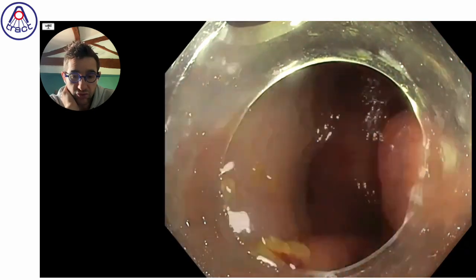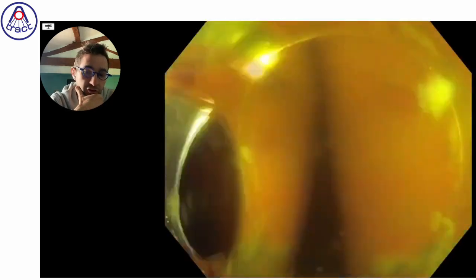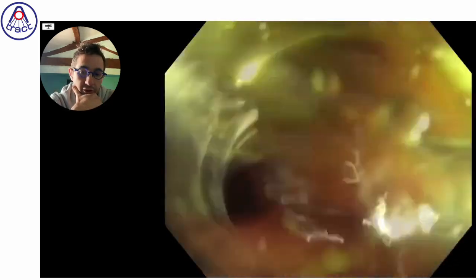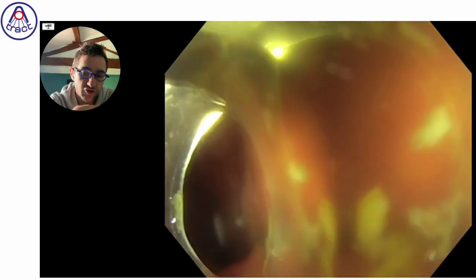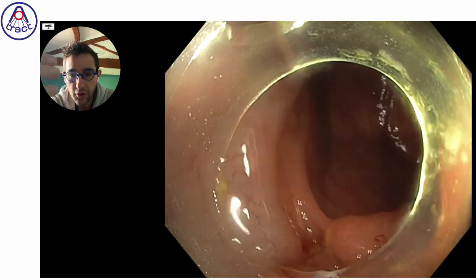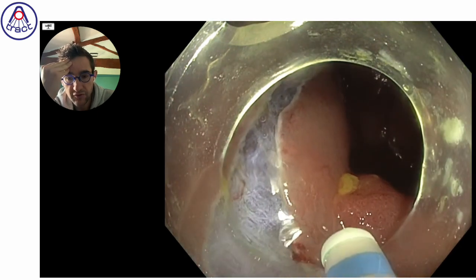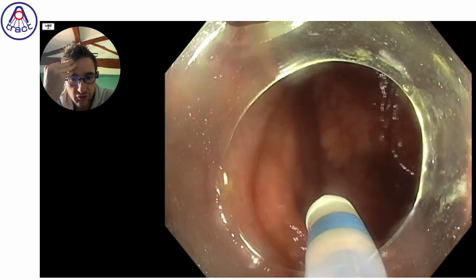We could manage to deal with it, but once again, when possible, it is easier to do everything with a relatively homogeneous and good flow of incision, because here you see that you have to find a solution.